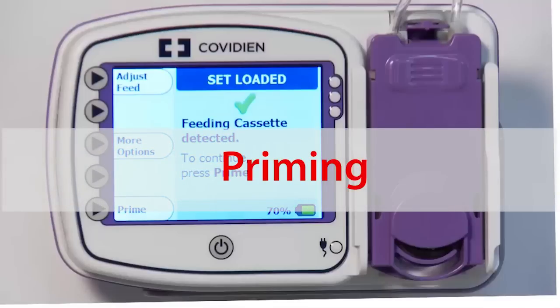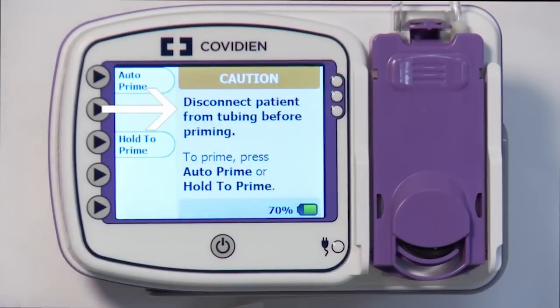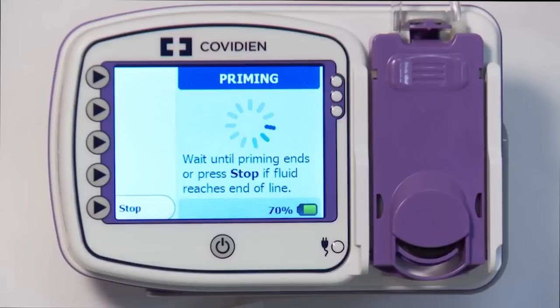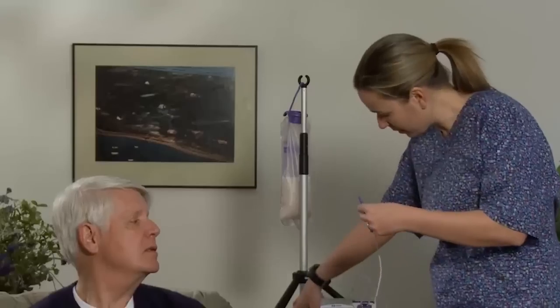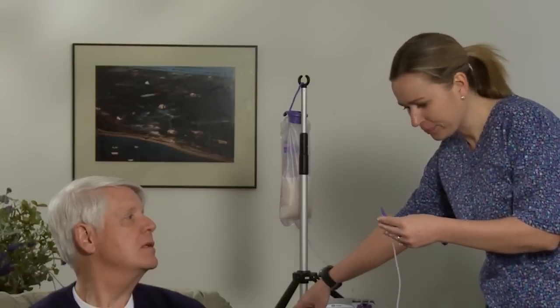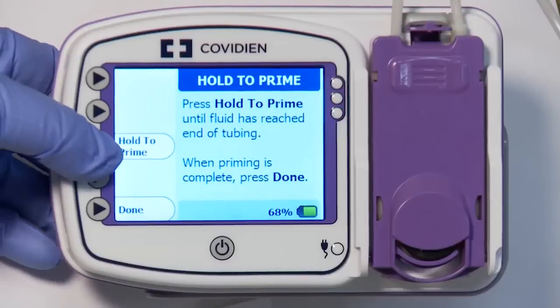You are now ready to prime the feeding set. Press the Prime button to continue. Note the warning on the screen. Select Auto Prime to automatically prime the feeding set. The pump will show an animated timing sequence indicating the prime is in process. Wait for the priming to complete. Once the Auto Prime is complete, the feeding solution will stop short of the feeding set connector. To top off the tubing, press and hold the Hold to Prime button until prime is complete.